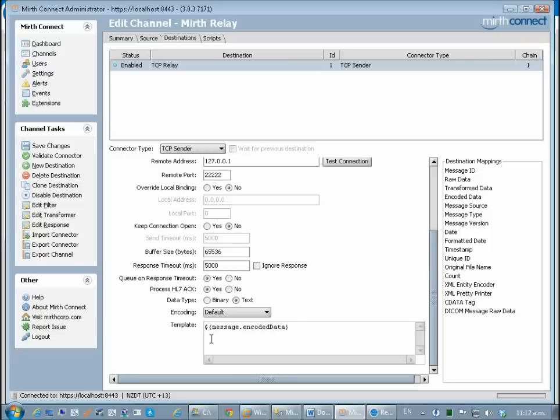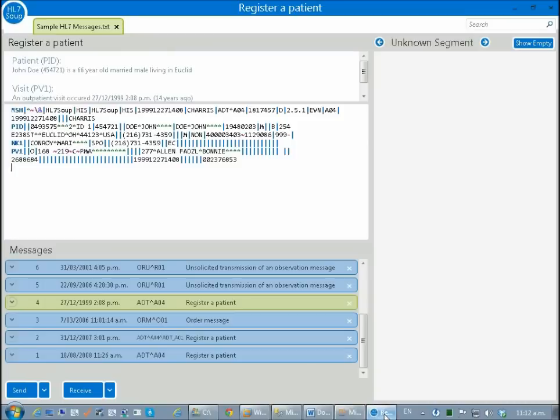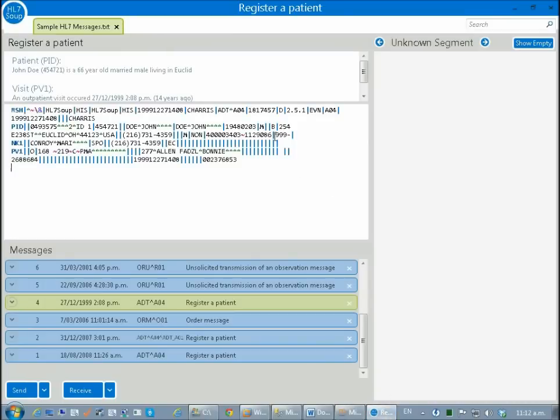I'm going to alter this message. It's preconfigured with the message that was received. Just for this demo I'm going to look at that message quickly. This is a message I'm going to send. It's an ADT A04 for registering a patient.